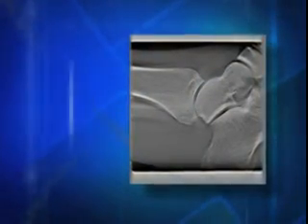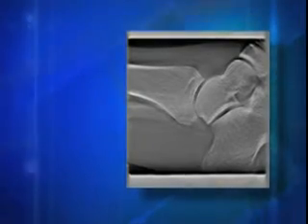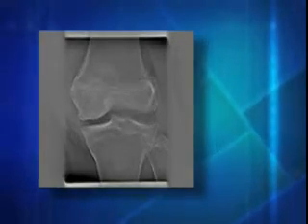The tomosynthesis images are able to remove the tissues above and below each layer using a mathematical process similar to computed tomography. This produces CT-like images that can be reconstructed at closely spaced intervals and reviewed by a physician, much like a conventional CT study would be reviewed.